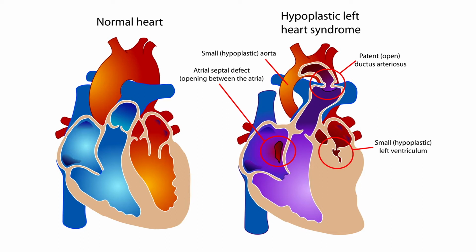So that was a quick run through the key tips when intubating a baby with duct dependent congenital heart disease. The two main things to watch out for are these babies, in view of their underlying cardiac anatomy, are unlikely to tolerate intubation well. So be prepared for this and optimise them. The other thing is you're going to want to limit your oxygen content to 30 to 40% oxygen at most, and be particularly careful with babies with univentricular anatomy, and make sure you don't hyperventilate them.